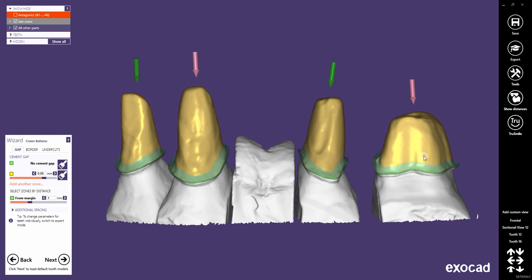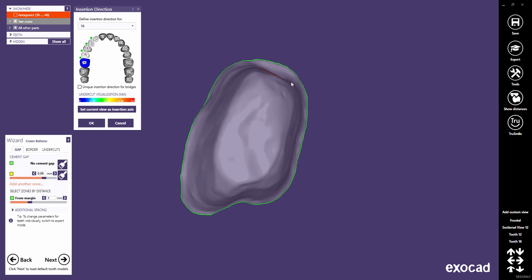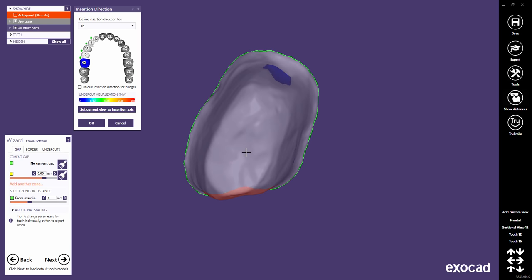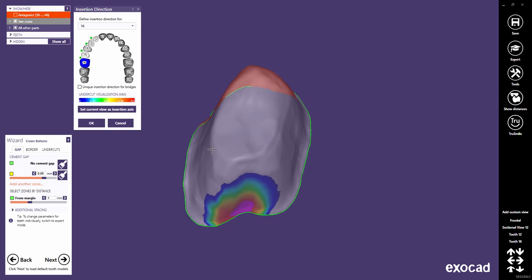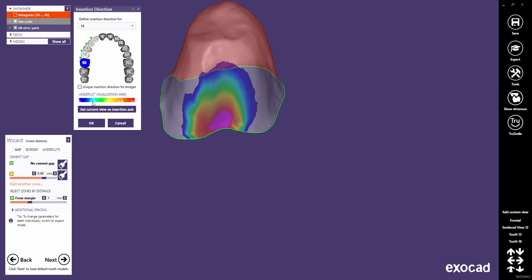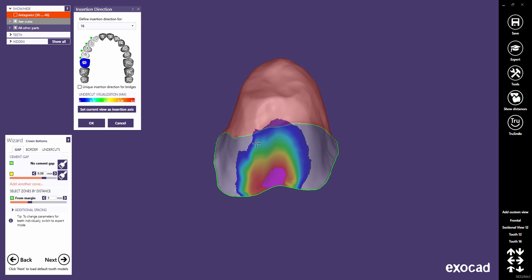Rotate the view so that you look onto the preparation from the desired insertion direction. While rotating, undercuts are marked in red. Then click 'Set Current View as Insertion Axis' to define the view as the new insertion axis. Once the insertion axis has been applied, the depth of the undercuts will be displayed corresponding to the color scale.